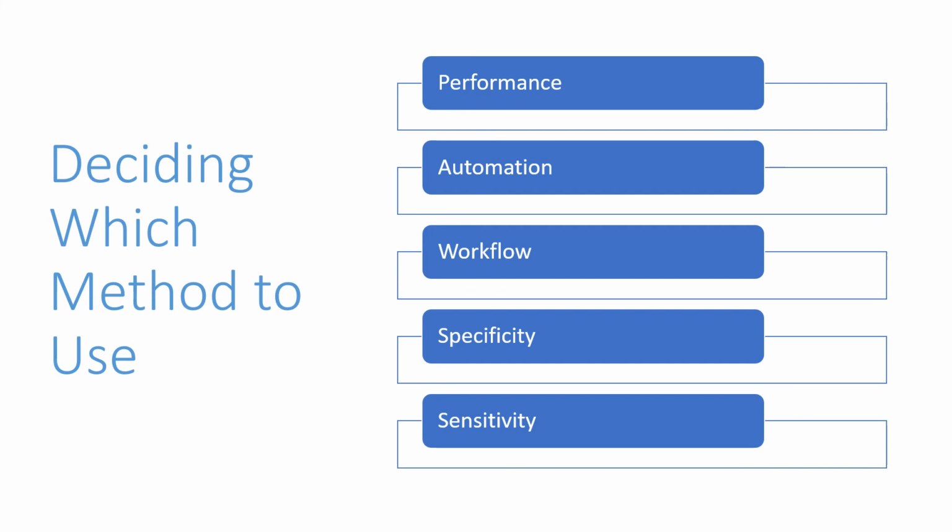Automation is also an important factor when deciding which test to use. EIAs can be performed manually, although more often than not, labs perform this test on semi-automated or automated platforms. The semi-automated platforms may dilute patient samples and add reagents to the plate, but technologist intervention may be required to wash and move plates to an absorbance reader.